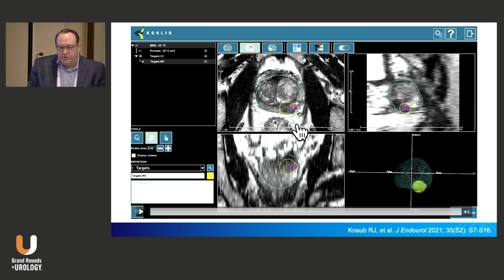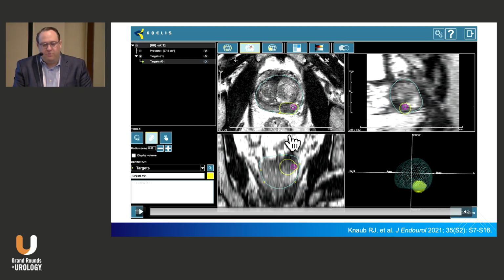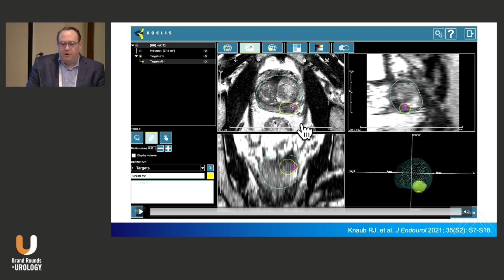I don't have the radiologist do it, and I do it for 2 reasons. There's a patient-centric reason, and then a Dr. Gorin-centric reason. So the patient-centric reason is the fact that I am intimately aware of where this lesion is. It's not a black box to me. I don't just simply open up the images onto the biopsy system and then point and shoot. By me actually contouring the prostate and contouring the lesion, I know every nook and cranny of this prostate, so that way, when it's time to do the biopsy, I can land my needle exactly in the right spot.